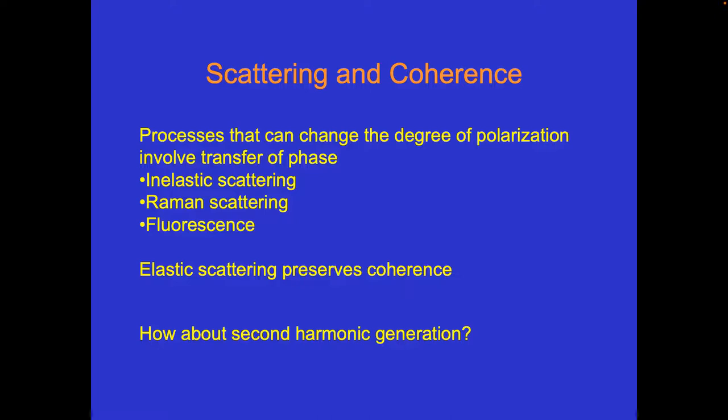If I look at the electromagnetic field that I measure, it's going to be very constant polarization. What makes it random is that I move a little bit, then I measure completely different polarization. So I move a little bit. Really different. So the definition of degree of polarization is actually not that easy, and you have to really think about the concept. What does it mean? Is it randomized? Yes, after a scattered medium, if you average over a certain area. But if you look at one point, it's definitely still perfectly polarized.